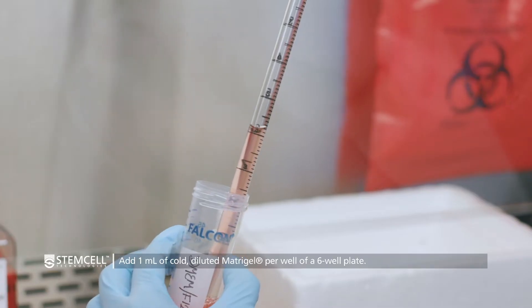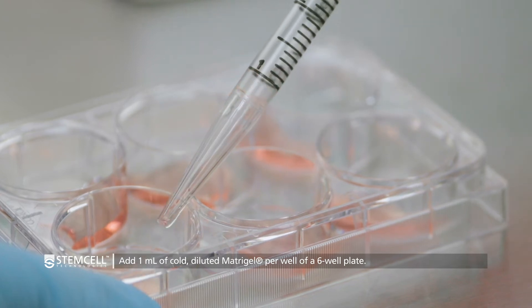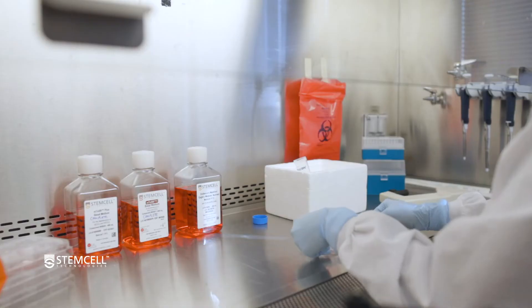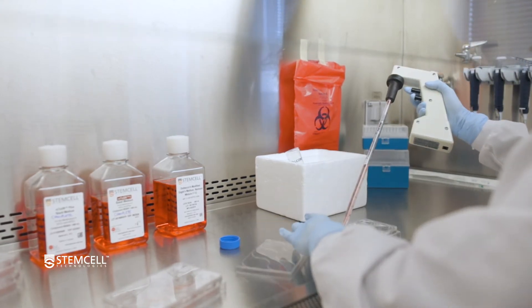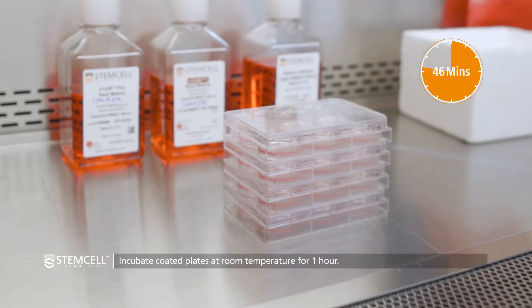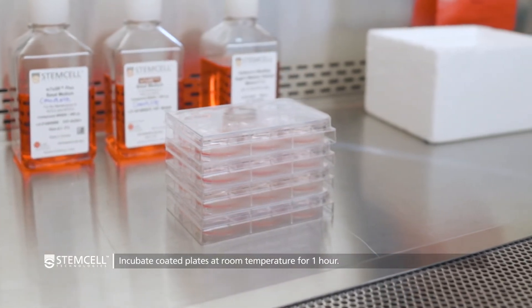Add 1 milliliter of the cold diluted Matrigel to each well of the tissue culture-treated 6-well plate and move the plate to ensure that the Matrigel solution has evenly covered the entire surface of the well. The diluted Matrigel is enough to coat 4 six-well plates. Incubate the plates at room temperature for at least 1 hour before use, ensuring that the Matrigel solution does not evaporate.